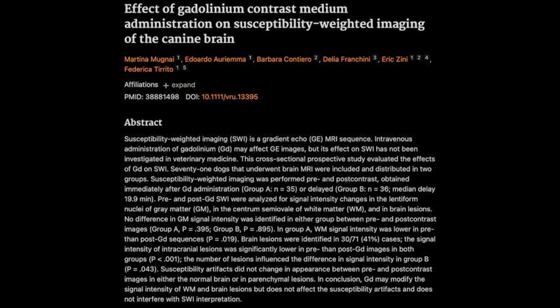Right, so they made the analysis easier, but maybe lost some information along the way. And lastly, the diagnoses were made using what they saw clinically, what the MRI showed, and cerebrospinal fluid analysis, but they didn't confirm with histopathology, which is the gold standard. Right. But it's not always possible or ethical to do histopathology for every case. So even with these limits, the findings are still pretty important.